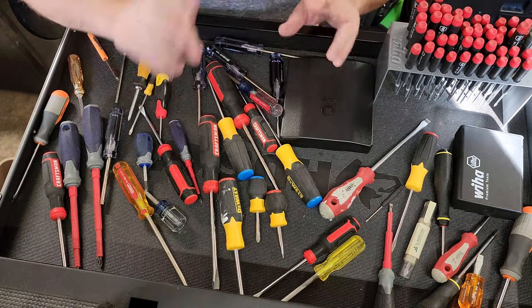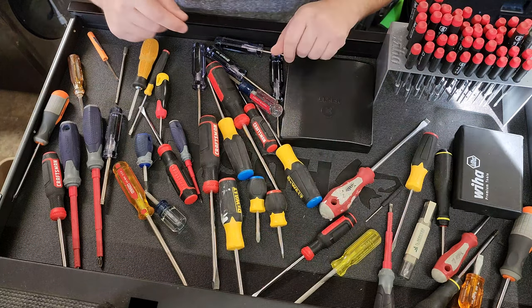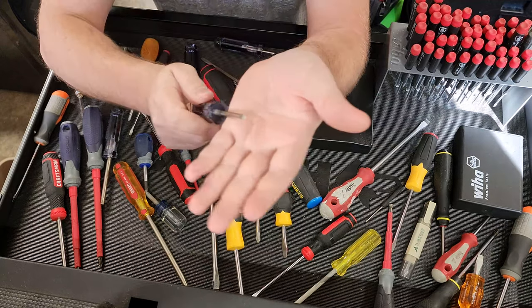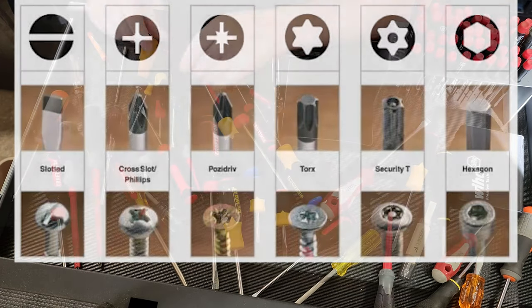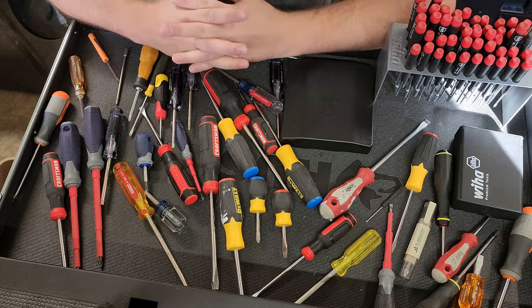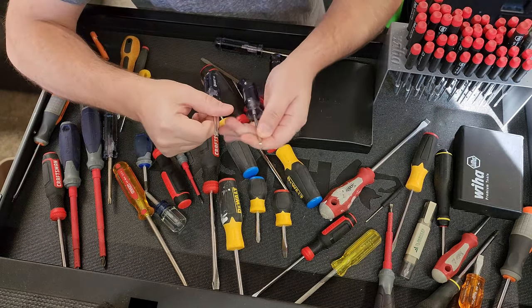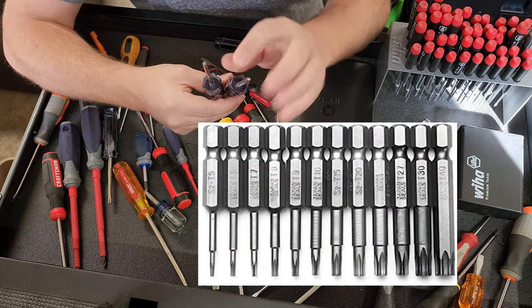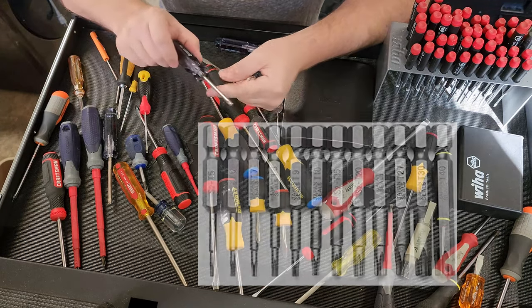So those would be your two main varieties — you've got the flat blades and you've got your cross point. One of the other main ones that we are going to use as a biomed is called a Torx. Torx is a six-pointed star bit. Torx come in sizes like T10, T25, T30. One of the interesting things about Torx is that the larger the number, the larger the Torx — so a T10 is going to be much smaller than a T25. You can see I've got all sorts of different Torx.